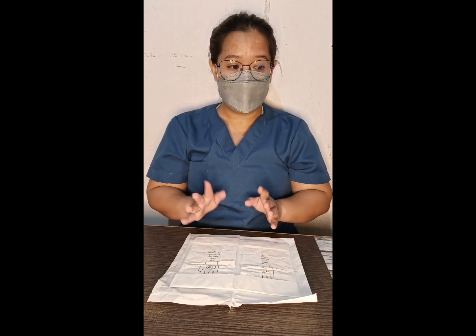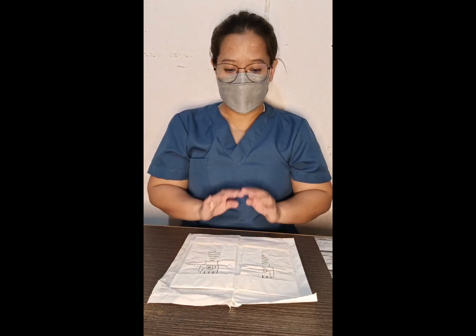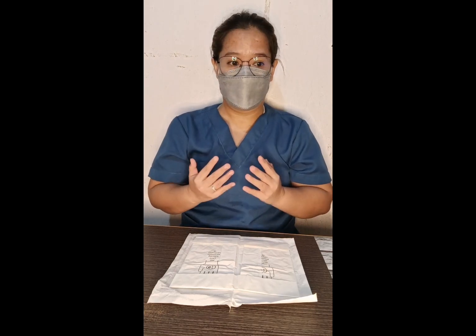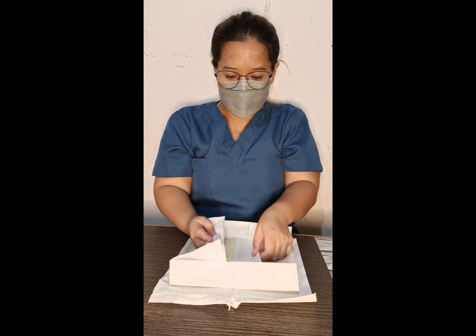We need to put the sterile gloves on a clean, dry surface. You can put the wrapped gloves on the sterile supply wrapper. Open the inner wrapper so that you can see both gloves. So this is how we do it. Right now we will be putting on our first glove. So we'll open this one. Make sure not to touch the sterile gloves.